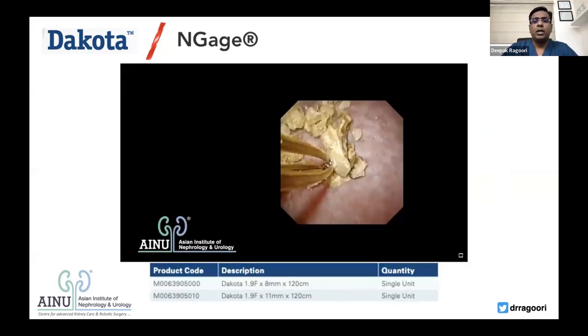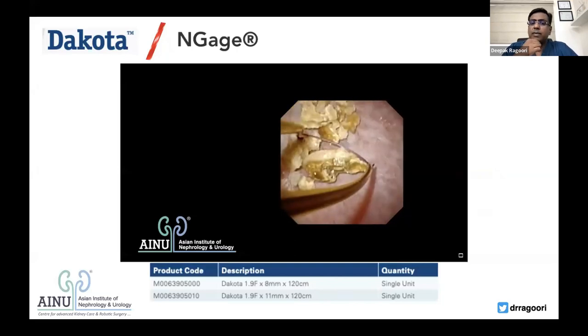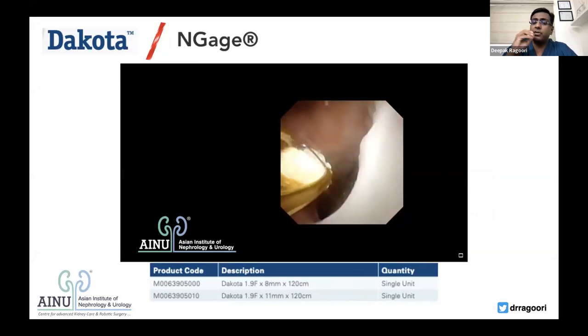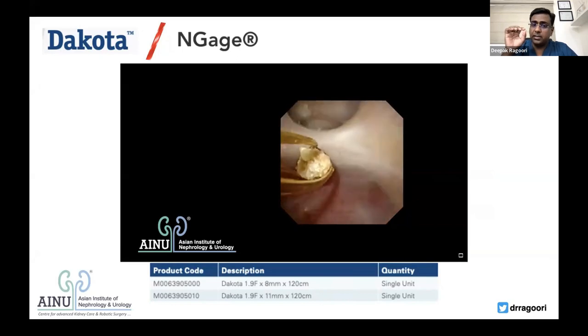I'll show you a small video. If you can appreciate in this, my hand wouldn't move much. I'm very stable with what I'm doing with the basket there. But the ability for the basket to open as wide as it can, or as small as it is, is very versatile.